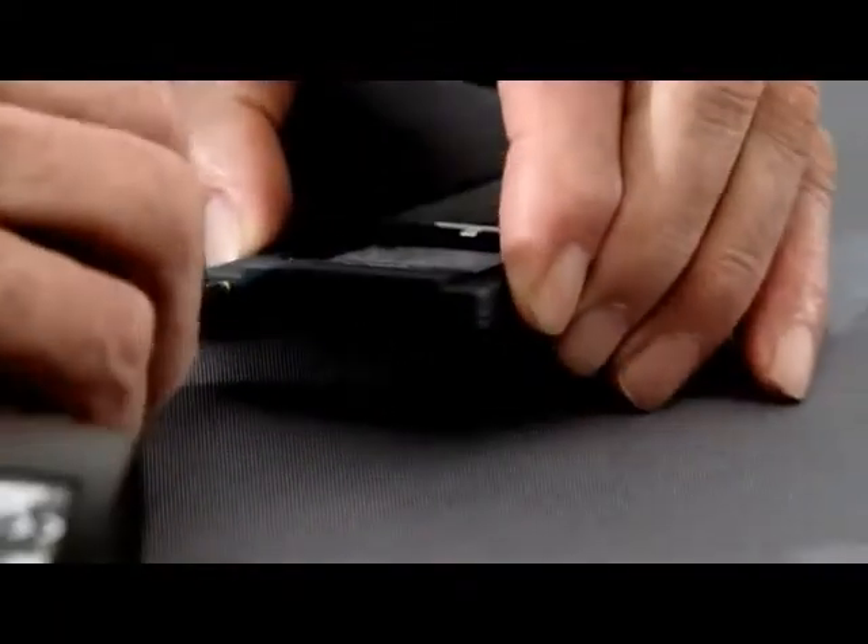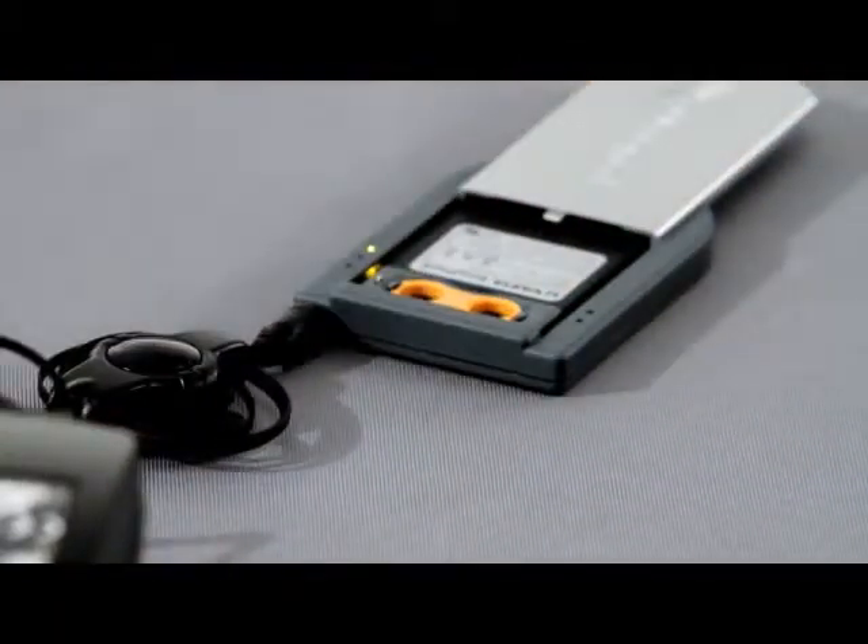The light on the unit meanwhile will be lit up yellow while charging. This single charging allows you to recharge your batteries repeatedly, depending on the battery type.